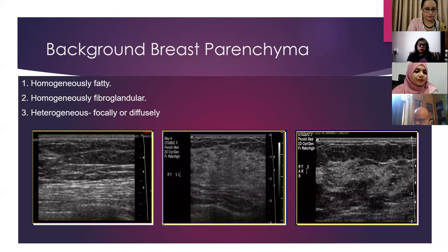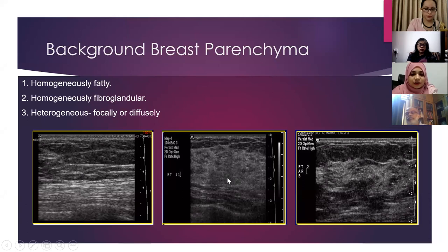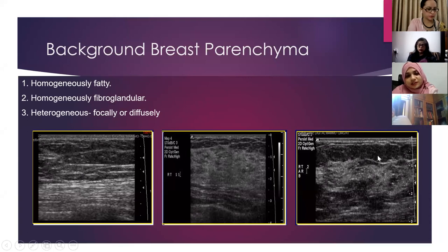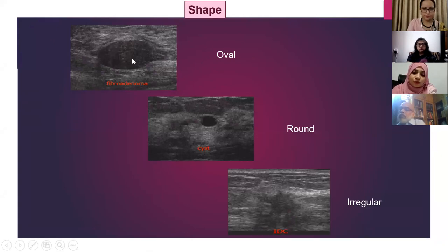The breast parenchyma can be homogeneously fatty, homogeneously fibroglandular, or heterogeneous — either focally or diffusely. In this first image you can see a homogeneously fatty breast, and in this one the echogenic component is more — it is homogeneously fibroglandular. This one is mixed, having heterogeneous parenchyma. Regarding the shape of the lesion: it can be oval, rounded, or irregular.